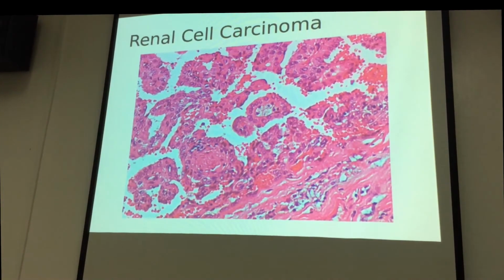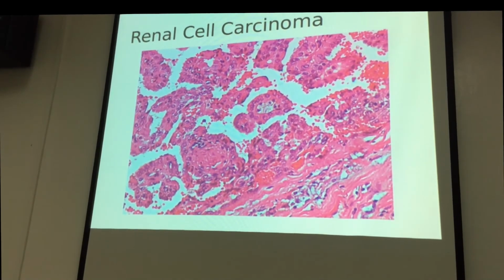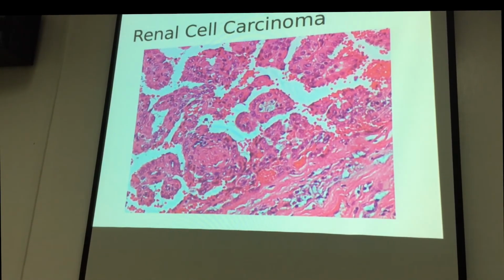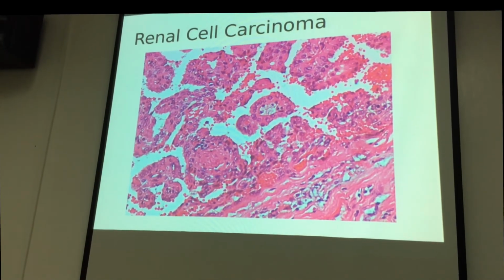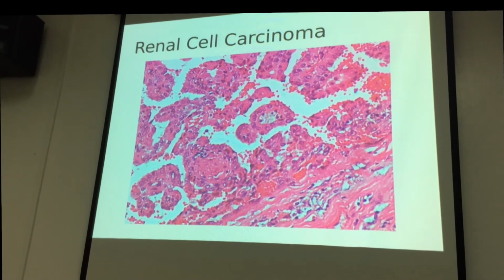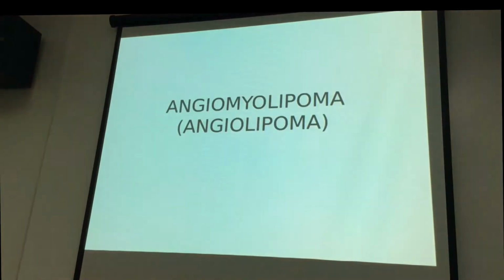Most of the time, what doctors do is they remove the entire kidney with the tumor, and you have to note for tumor invasion in the renal veins. So the patient will have a poorer prognosis if the renal veins will show islands of tumor cells.